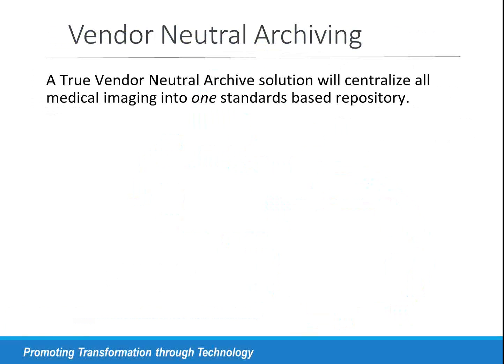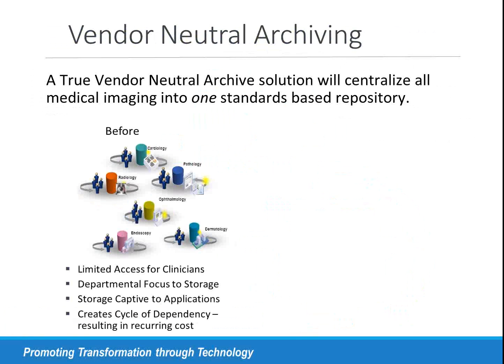So what we learned was that a true vendor-neutral archive solution centralizes all the medical imaging into one standards-based repository. Before, I think Shannon might have alluded to this in his part of the presentation, you had all these potential islands of information. If you were working with an image archive vendor that was unique to their particular solutions, you might find that in the case of cardiology and radiology, the cardiology system had to have its own archive, and the radiology system had its own archive, and those were captive to those individual platforms.